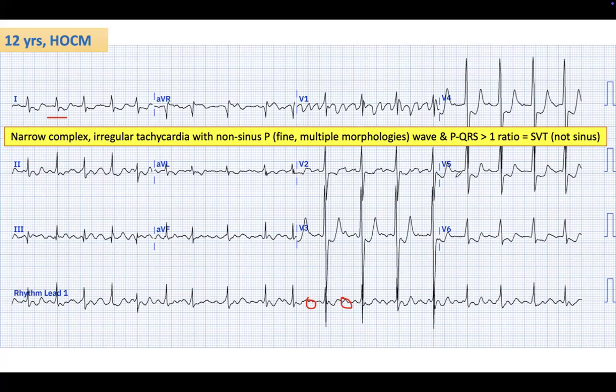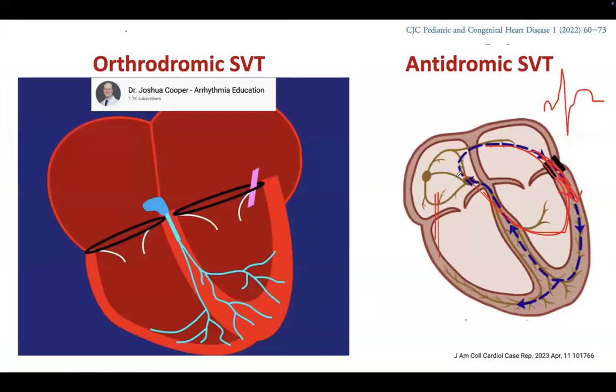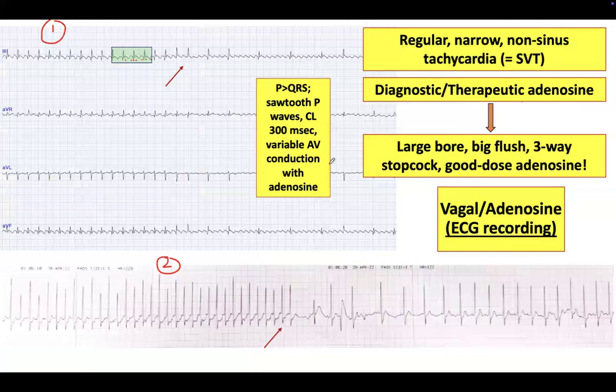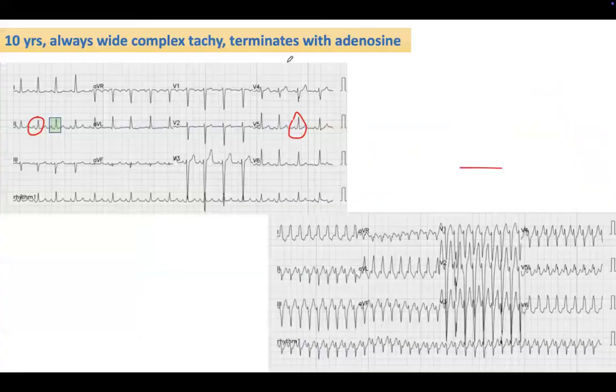Finally, this is AFib, not flutter. It's irregular, and the P waves have different morphologies. Flutter should have P waves that are identical, like the example we showed before. Remember this one? This is flutter: regular PP, same P wave. This is fibbish, atrial fibrillation.